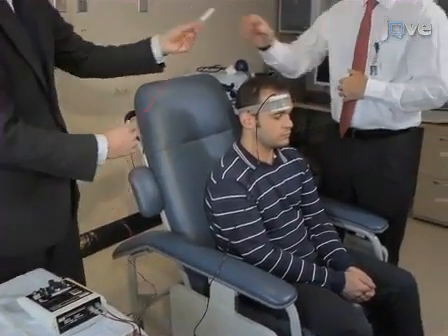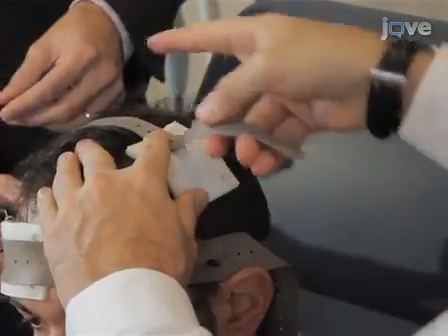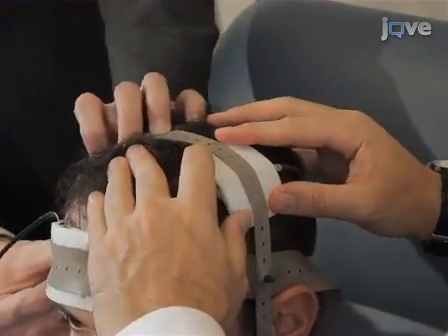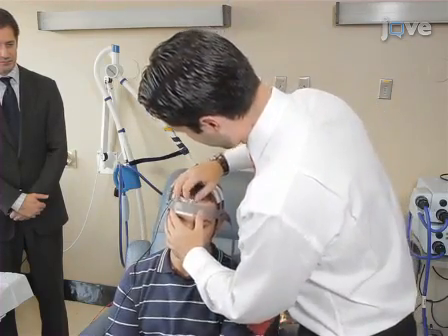Next, connect the second elastic head strap to the first one according to the desired electrode montage. Here, stimulation over primary motor cortex will be demonstrated, so the sponge that will hold the anodal electrode is placed under the second elastic head strap over the M1 location. Assure that the sponges are not excessively wet, but moist enough to have good electrode contact.